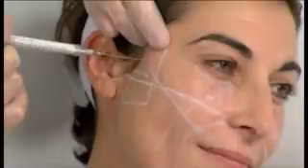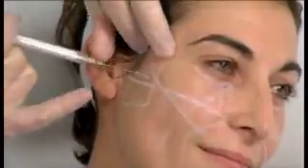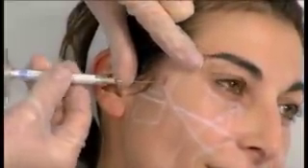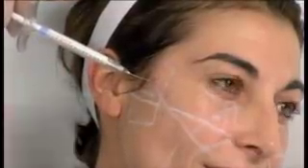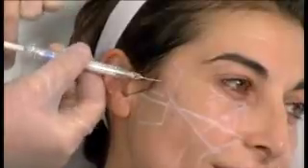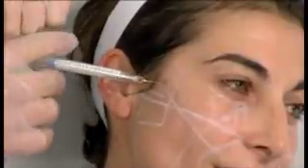Okay, so now we'll begin, and we can clearly see where my injection site is because there's a little bit of blood coming out. And so we have to insert the needle. Hey, I do feel a little bit of struggling here. Okay, so that's no problem, because what you could do is you can use kind of a pencil rolling way, and you kind of drill your way into the skin until you're inside. It does take a while before you can get adept, and if you have a patient that's had a facelift or something, it's very hard actually to get it through. Mm-hmm. Because of all the fibrosis, yes. And this is a very nice trick that I've learned, is to really roll your syringe. If you do that and at the same time advance it, it's much easier to get to the fibrous tissue.